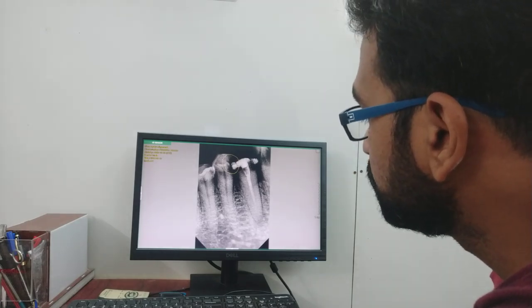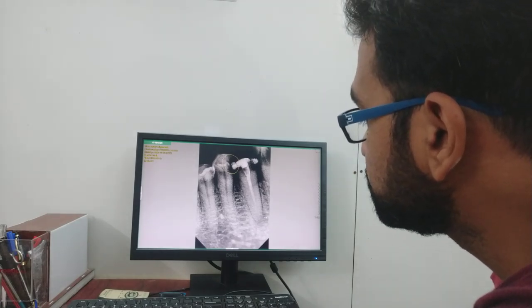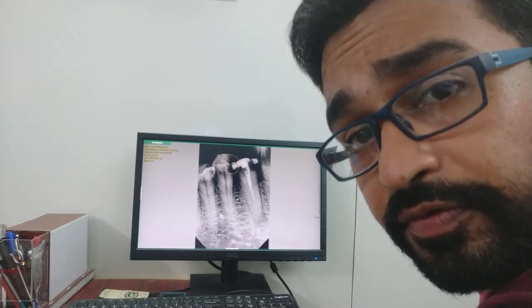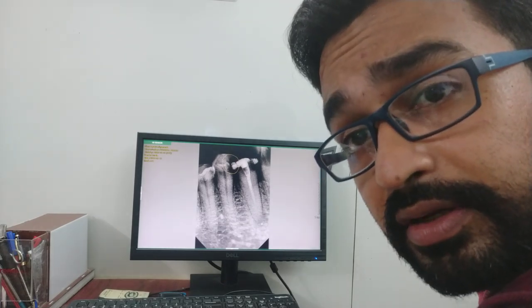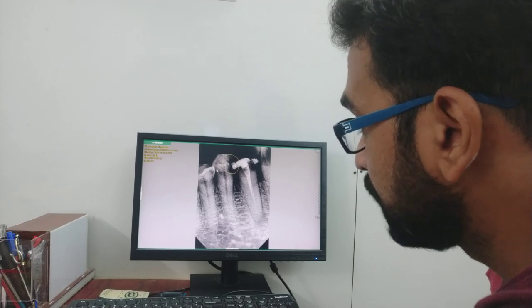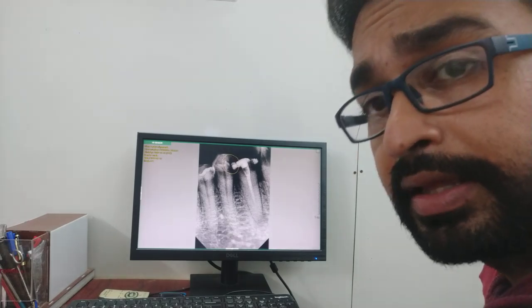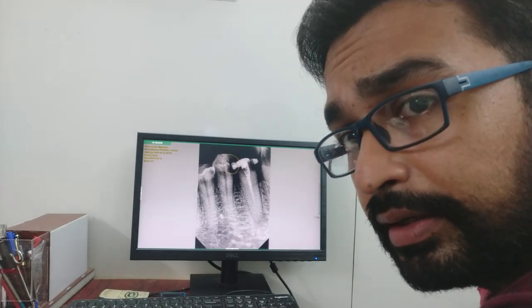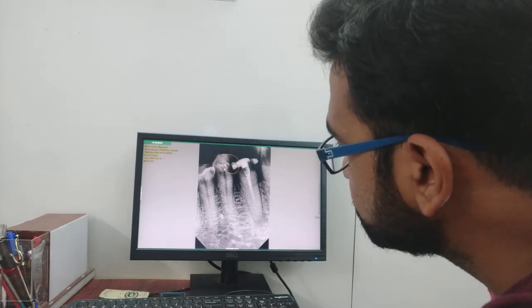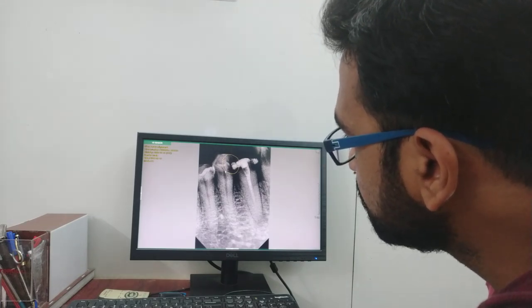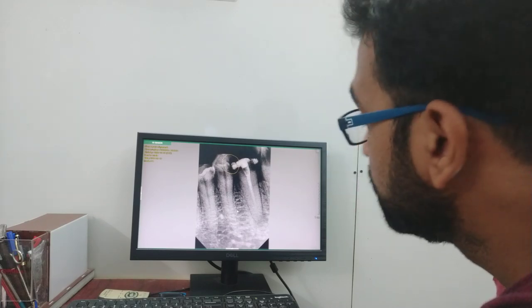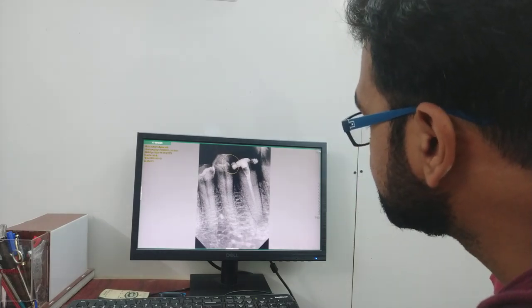For this periapical lesion, I have not planned to extract the tooth. I will keep the calcium hydroxide for a few weeks and then do the obturation. But importantly, this X-ray led me to another finding in the same patient — the first premolar is also involved and needs root canal treatment as well.